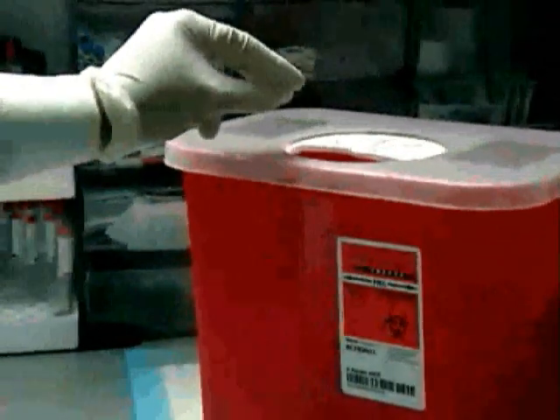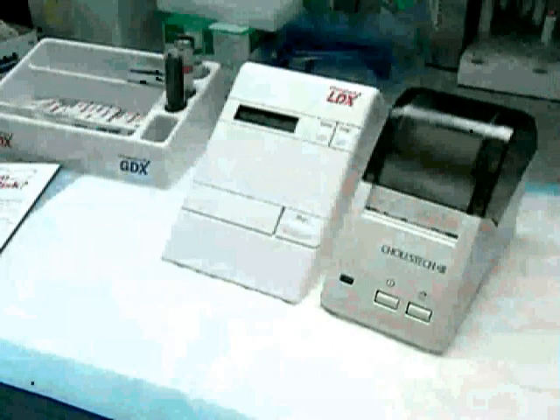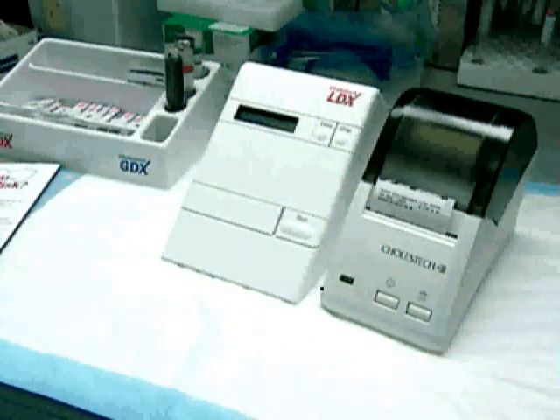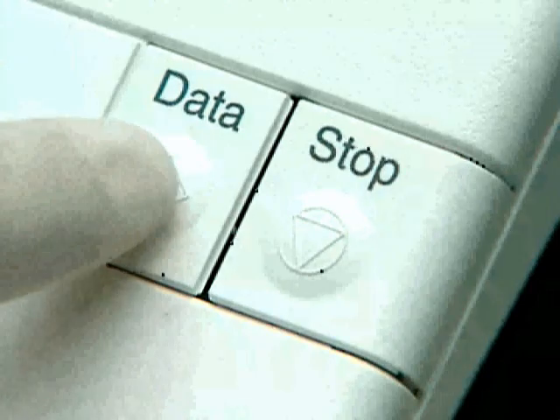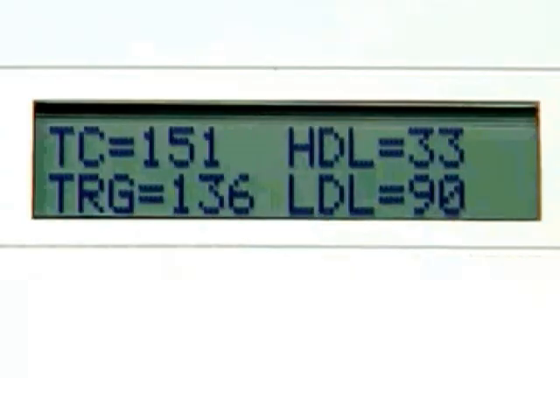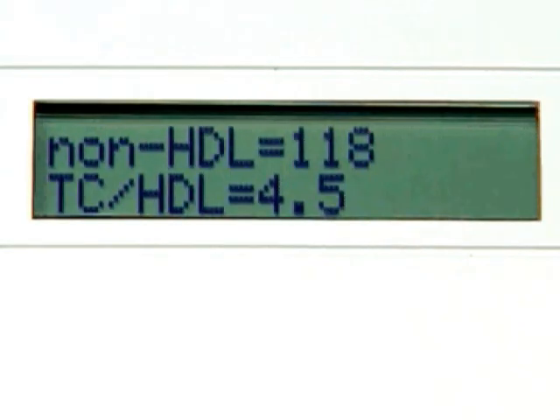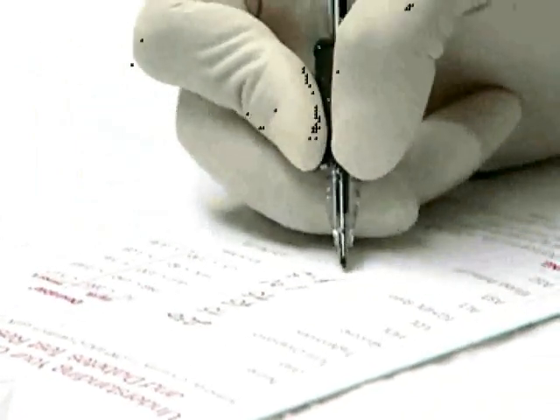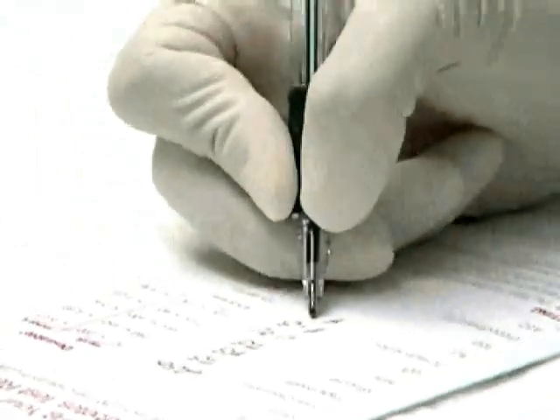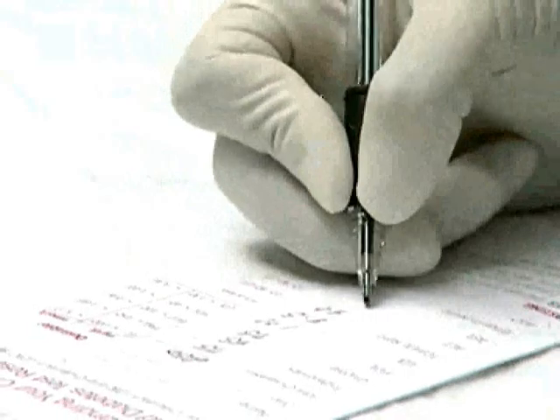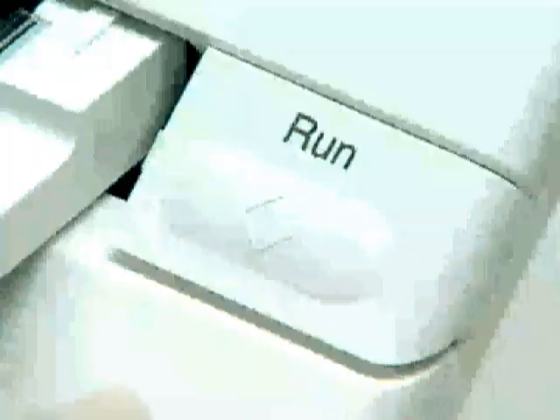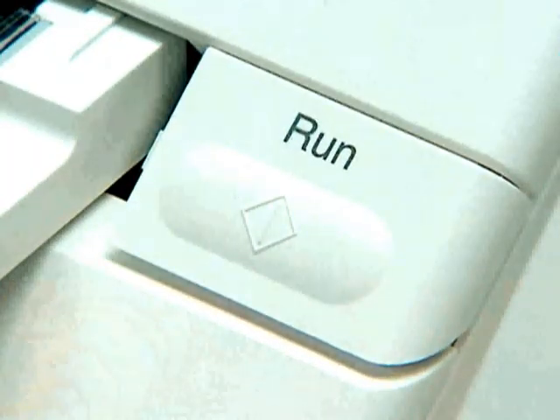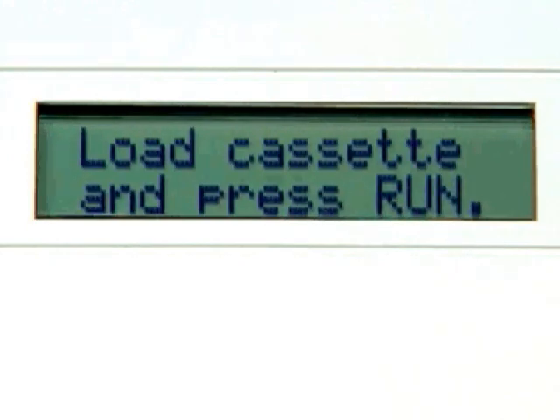When the test is complete, the Cholestec LDX system will beep and the result will appear on the screen. Press Data to obtain any additional or calculated results and record them on the patient result form. Depending on the test cassette, it may be necessary to press the Data button a third time to obtain all the results. After a test has been performed, pressing the Run button once brings up the prompt to load a new cassette and start a new test.